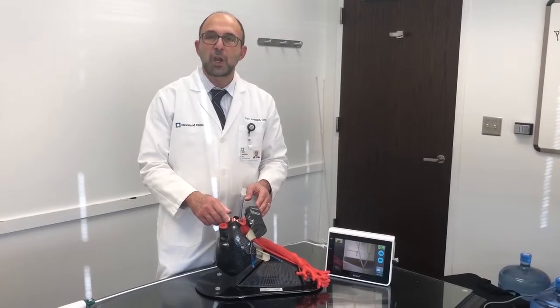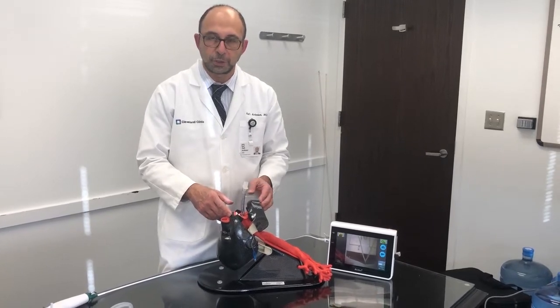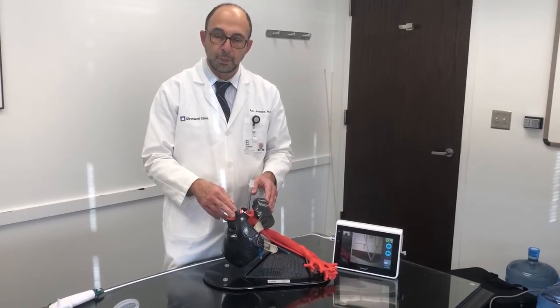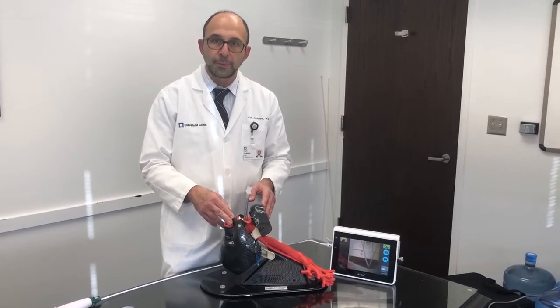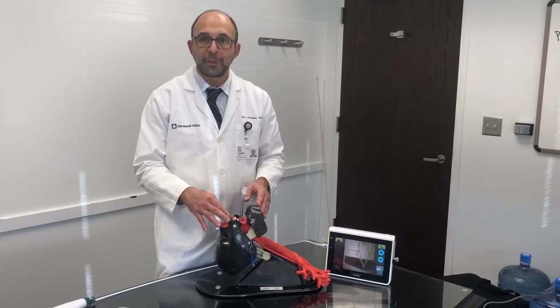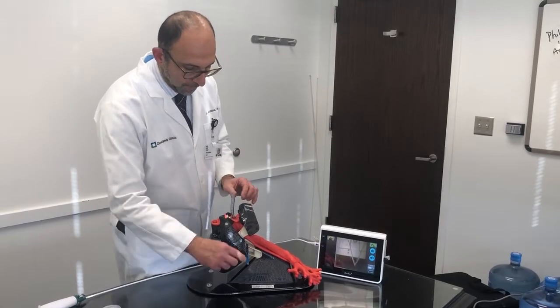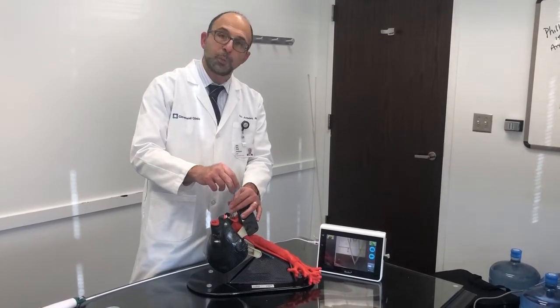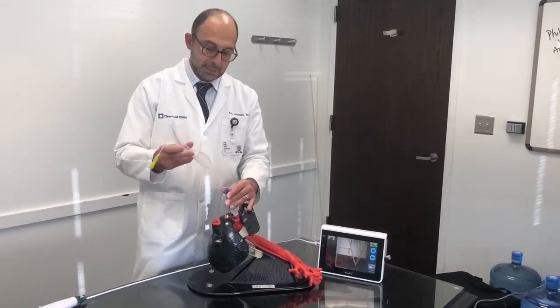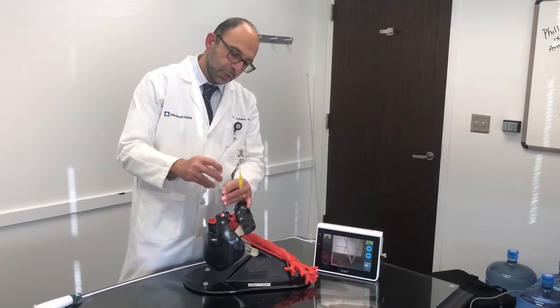As of now, no one has described the conversion of an endotracheal tube ventilation to a supraglottic ventilation without using an intermediate device such as an exchange catheter. But this is possible with an AZ airway. In order to convert an endotracheal tube which is already placed to a supraglottic ventilation, the adapter part of the endotracheal tube is detached. The pilot balloon of the endotracheal tube is placed in the endotracheal tube at this position, and the AZ airway is introduced over the already positioned endotracheal tube.